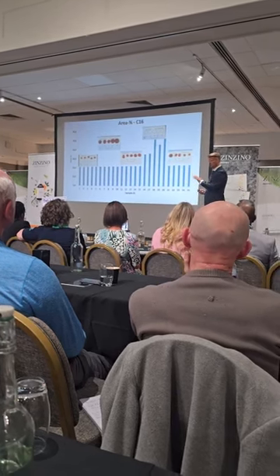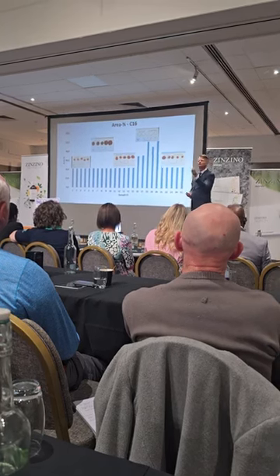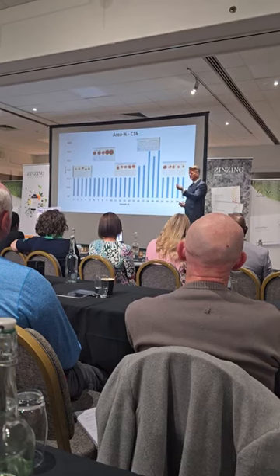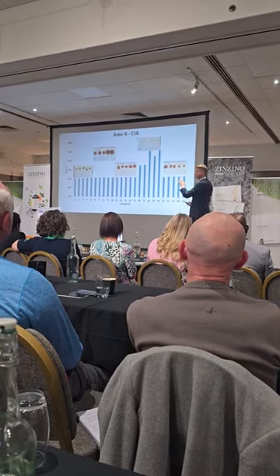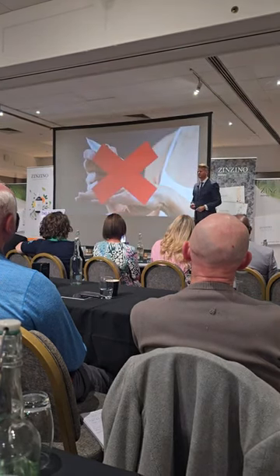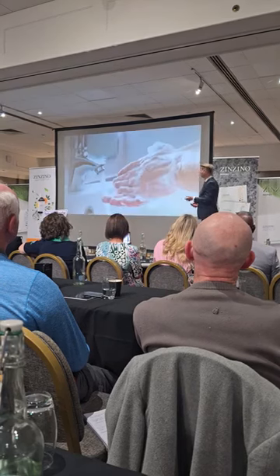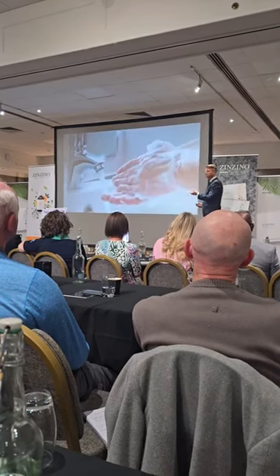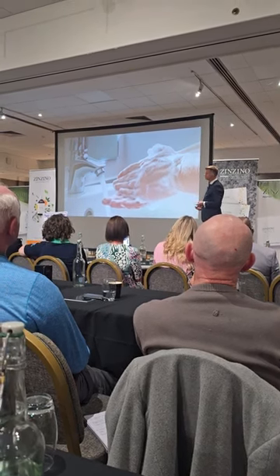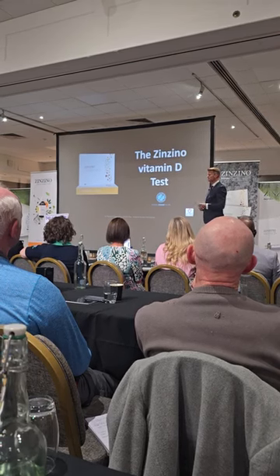Someone, me, touched the paper with my fingers without washing my hands, right? If you feel your fingers, you can feel they are quite greasy. So the concentration of lipids is much higher than in your blood. Just by slightly touching the paper, you will ruin the analysis. So no hand cream. And what do we do to remove fat? We use soap, right? So, soap, warm water, rinse well to get them off, and dry off with a paper, and then you're good to go. And then this analysis works really, really well.